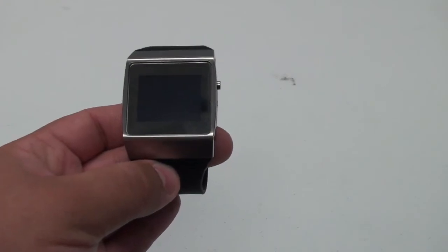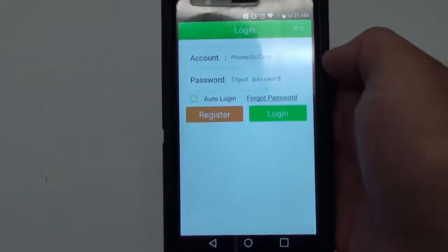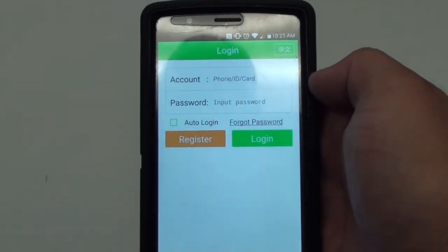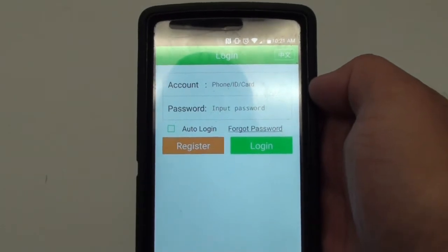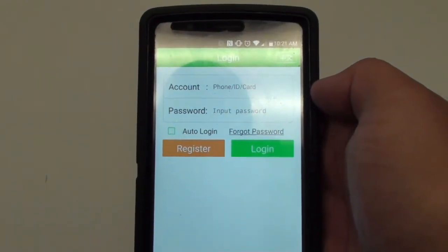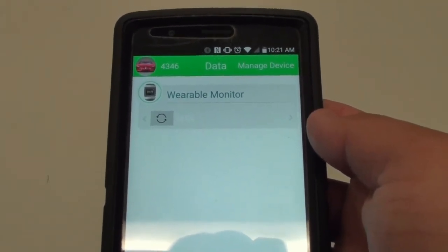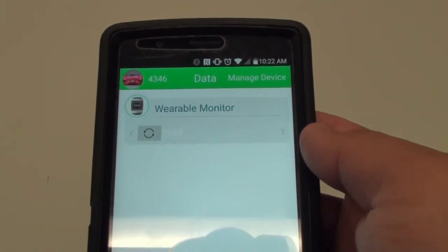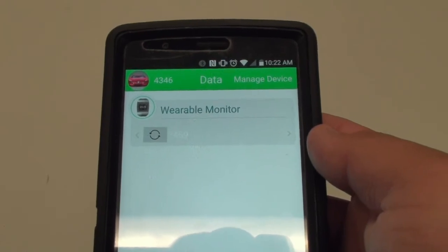The CMS50K's application is the PHMS. After downloading the application you'll see a login screen. All you'll need to do is register using your phone number and then it'll prompt you with your password. After you download the application and turn the device on, you'll be able to pair the device with your phone via Bluetooth.